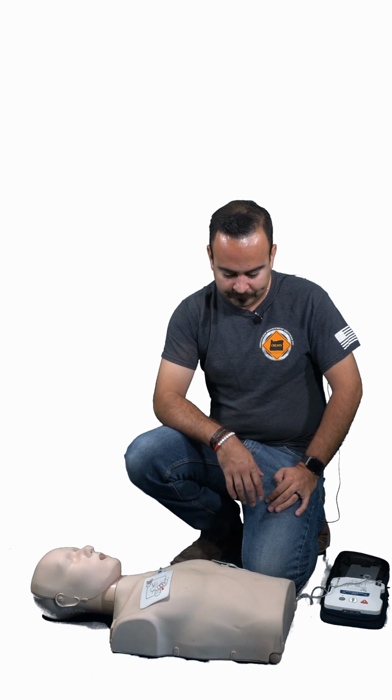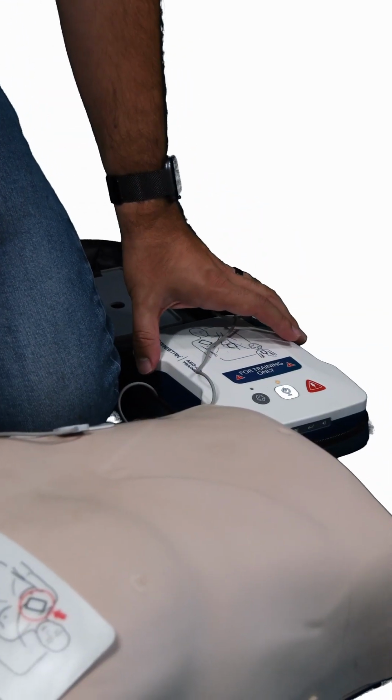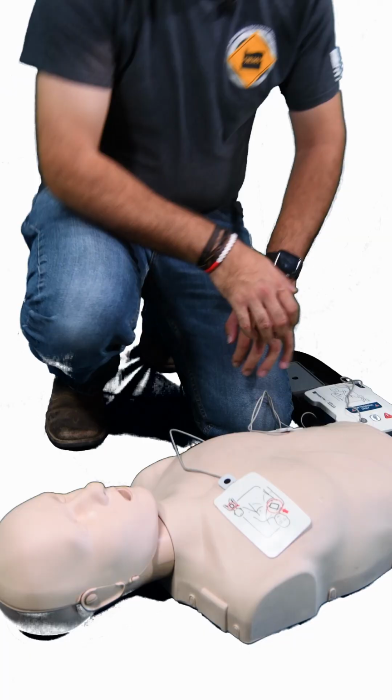Analyzing heart rhythm. At this point, we stop CPR. Do not touch the patient. Analyzing heart rhythm. Shock advised. Do not touch the patient. Everyone clear. Press the flashing shock button. Shock delivered. Begin CPR.